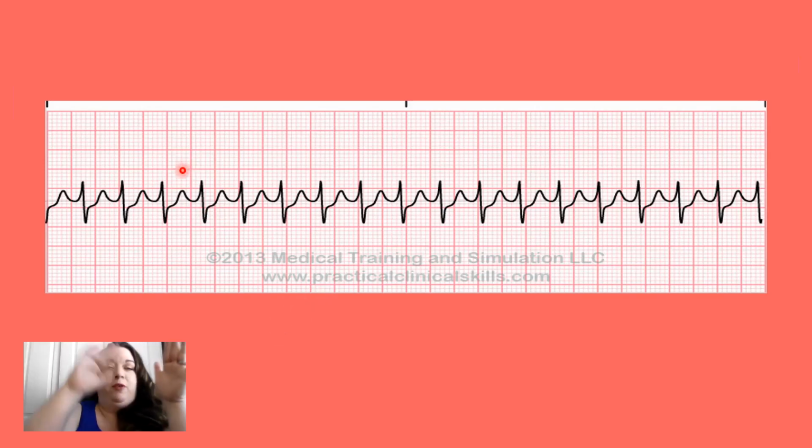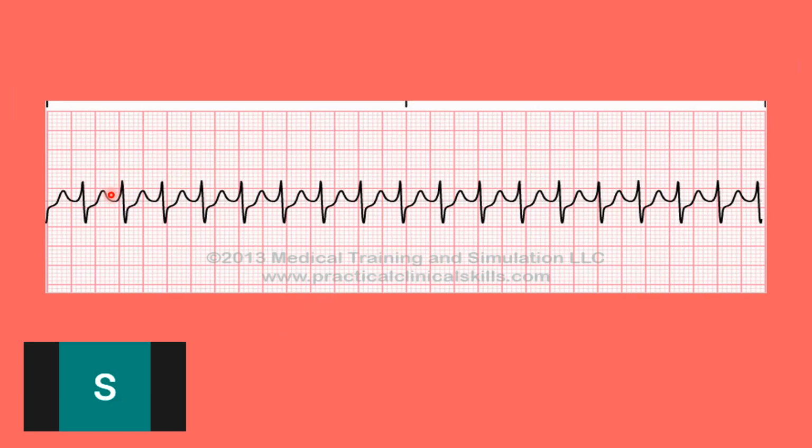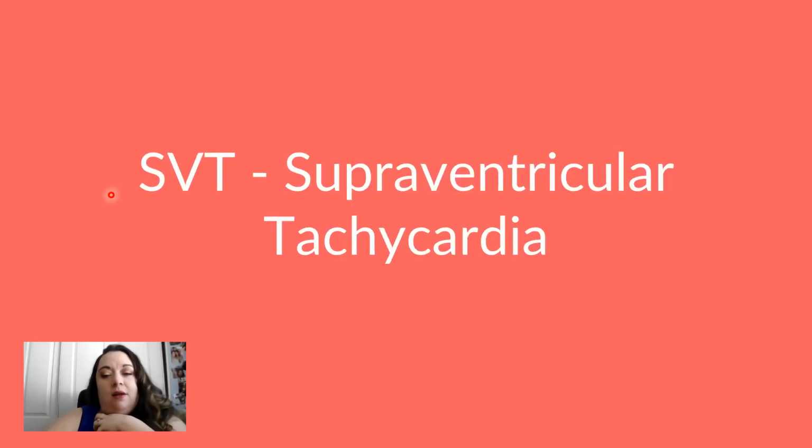If you have your P wave, QRS, T, there's usually a flat line, and then your next beat comes. As your beat gets faster, all that gets shoved together. So what you're seeing here, it could be a P wave, it could be a T wave. It's probably both sitting on top of each other, okay? Any guess as to what this rhythm is? SVT. SVT, yeah. So it's supraventricular tachycardia. And that's usually if your patient's in a heart rate over 150.